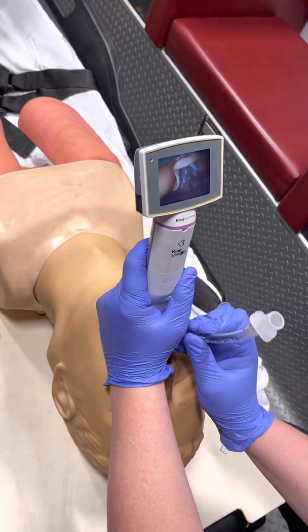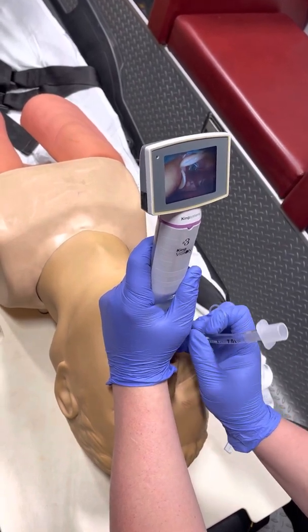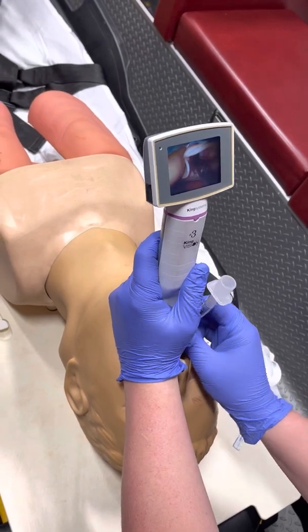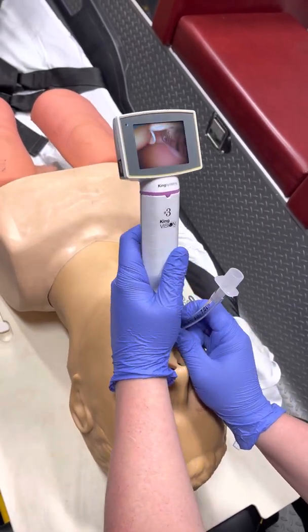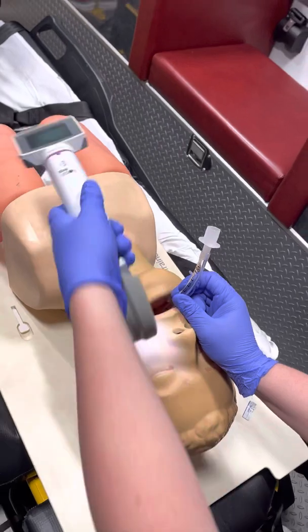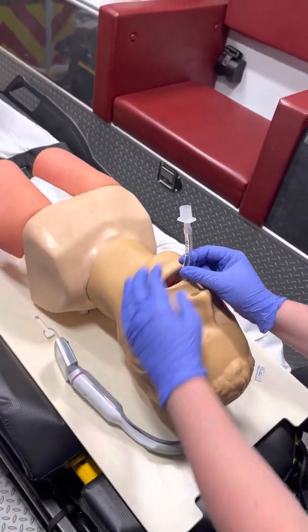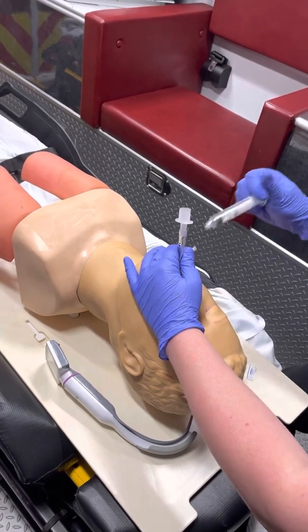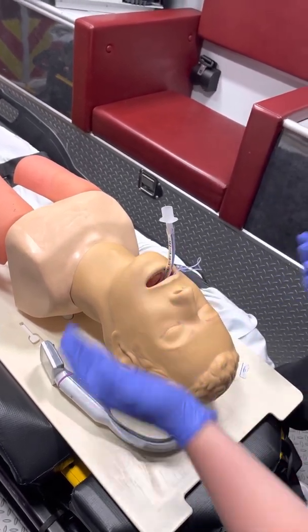While I'm advancing my tube, I want to make sure it's passing through that glottic opening and the balloon is fully through the vocal cords. From here I can go ahead and back my laryngoscope out and inflate my cuff. From here we would go ahead and bag our patient.